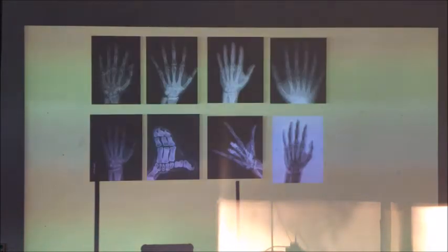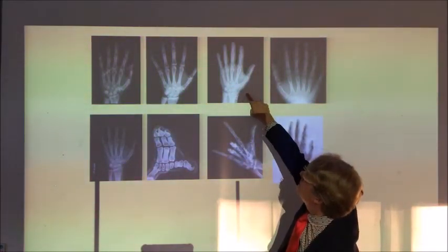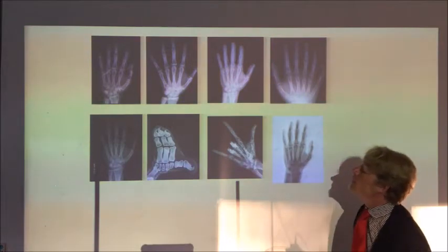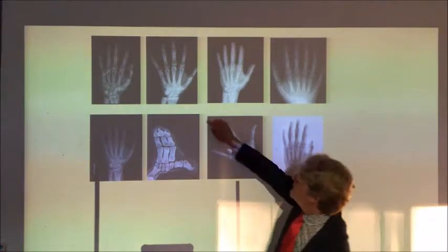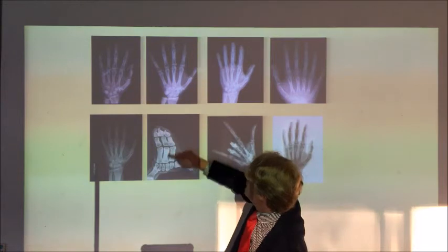So looking at some images here, the contrast on this image is not as much because we can see that soft flesh in there as well. If we were looking at the bones, the contrast perhaps isn't really high enough because we can see those other things. Maybe slightly softer X-rays, I would think. Whereas the edges of these ones are a little bit more clearly defined.